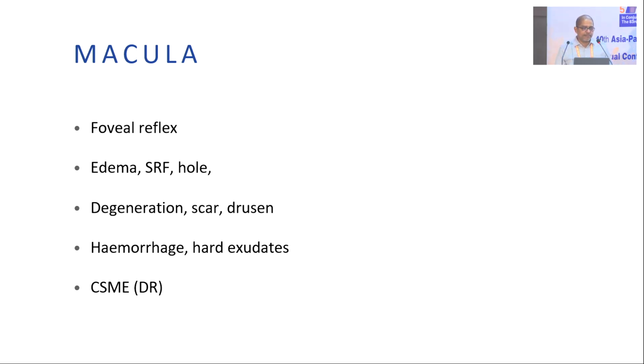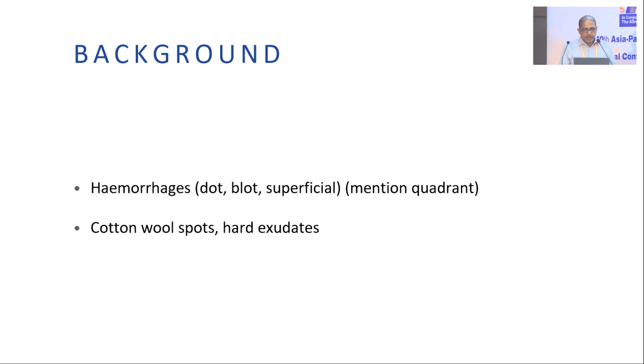A lot of people don't like it. You say whether it's present or absent, that much is enough. If it is absent, tell why it is absent. You say edema, hole, or SRF is there, or scar, or blood, whatever is there, or edema like a CME or a DME. So whatever is there, just mention why it is absent.